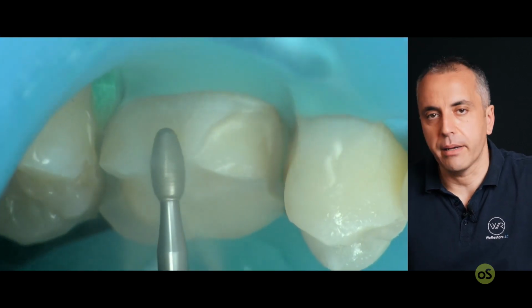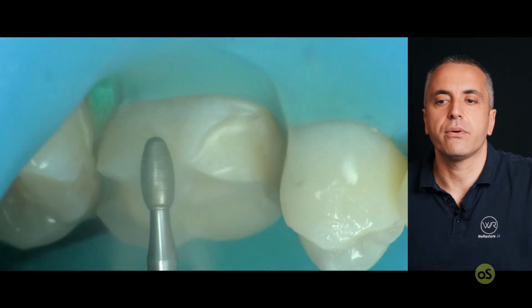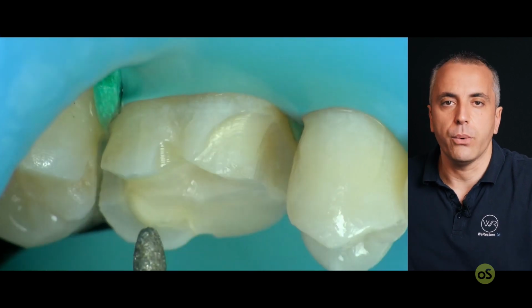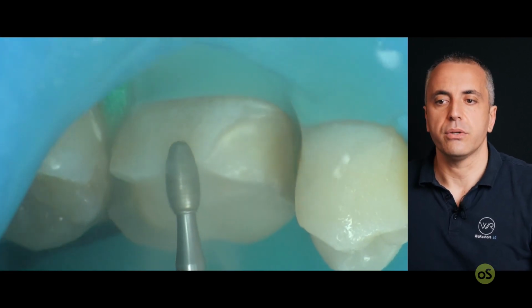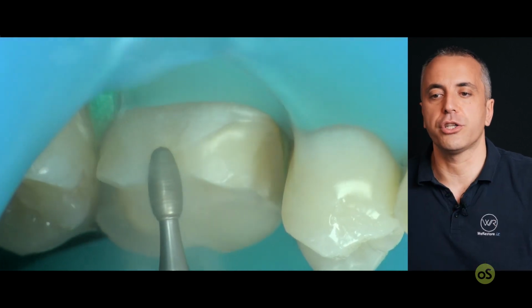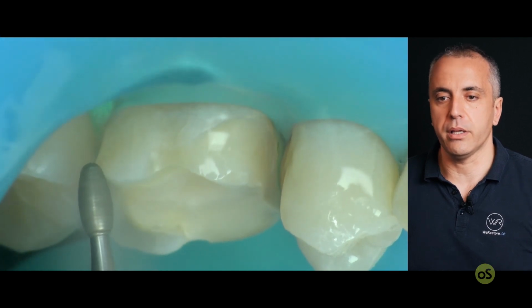Now we prepare the buccal part. The buccal part is prepared with this big chamfer. Of course, you don't have to think that it is an olive. We have to think about the diameter of the preparation we want to provide. So also in this situation we can start with a little notch of preparation, then we connect the mesial margin with the distal part.